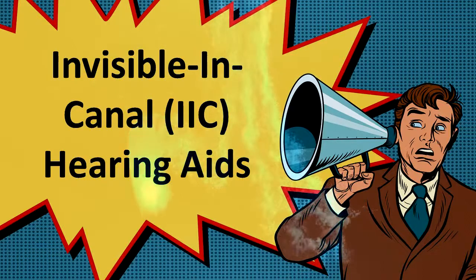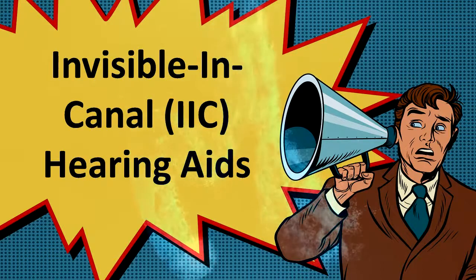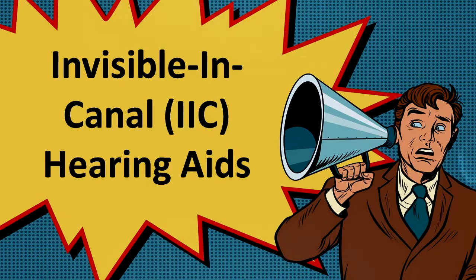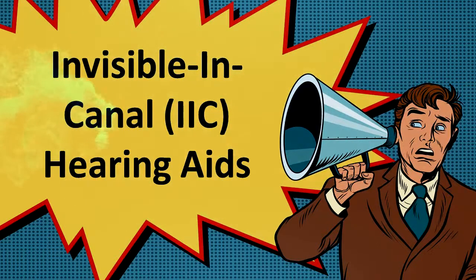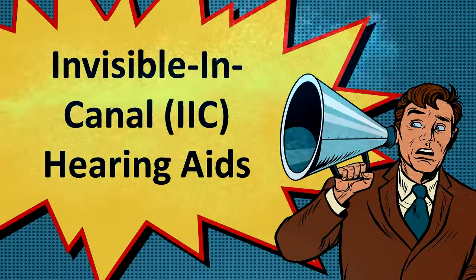One popular type is known as the completely in-the-ear aid or the invisible-in-the-canal hearing aid. For individuals who want to have a hearing aid but don't want conspicuous models, this option is very useful. As the name suggests, these types fit snugly into the ear canal, deeper than other styles. This makes the aid nearly invisible and completely inconspicuous. In most cases, a technician will take a mold of the user's ear so that the piece can be custom fit into the user's ear canal. If this sounds appealing, ask your audiologist if this style of hearing aid will work for you.